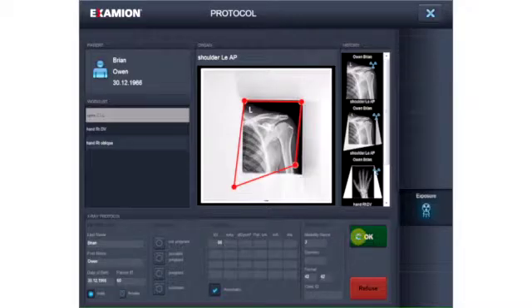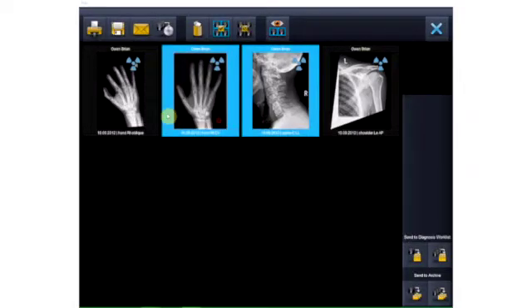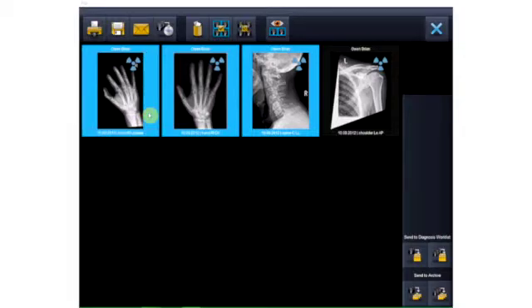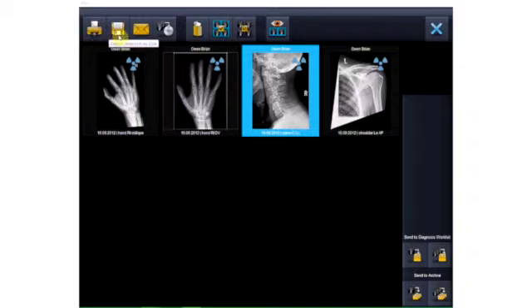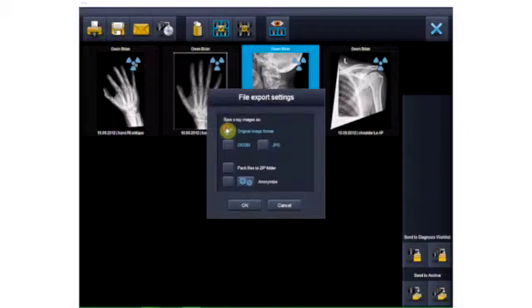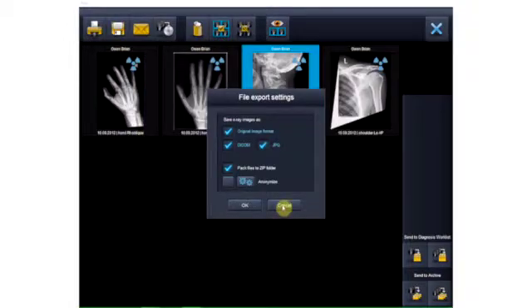After you have taken multiple exposures in a row, they are first displayed as thumbnail images on the overview screen. Before post-processing or saving in the archive, the selected images can be directly printed. You can also export your images and save them locally or on an external medium. You have the option of saving the images in the original image format as DICOM and/or JPEG, anonymized and as a zip file.